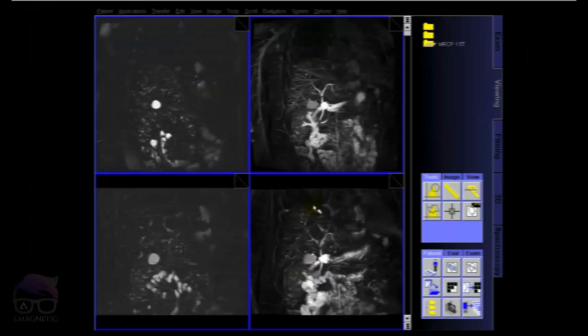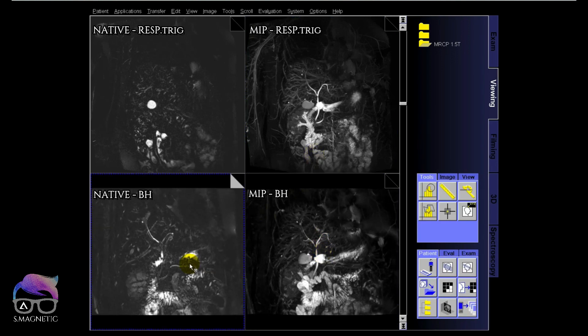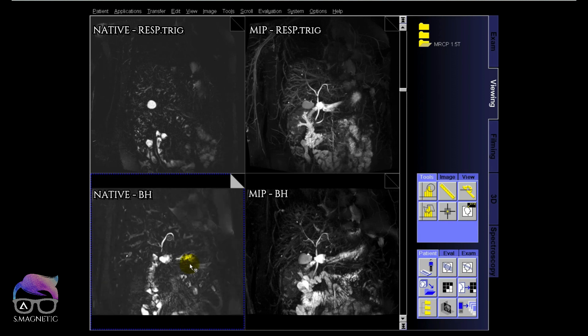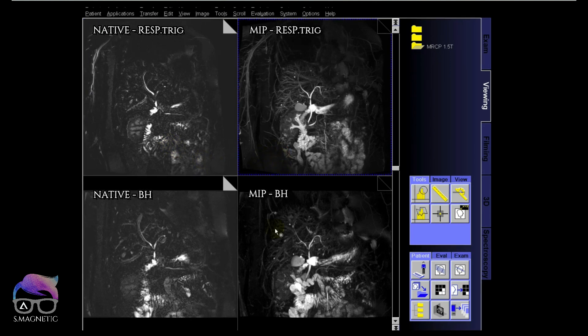Let's check the images in 3D mode. The upper row is the free breathing respiratory triggered acquisition and the lower row is the breath hold. You can see native images compared to MIPs next to them. Even though it's a breath hold it's not bad, and since not all patients can breathe consistently, having this as a backup option is great.